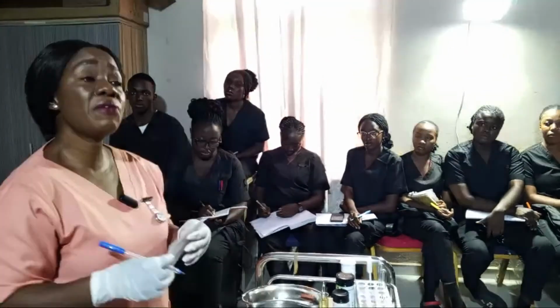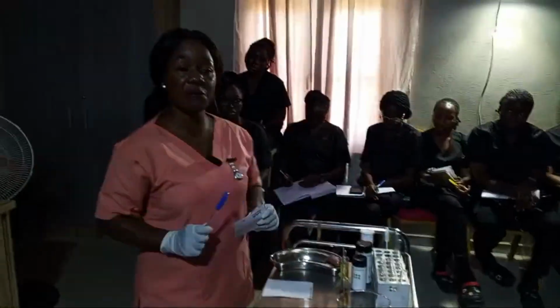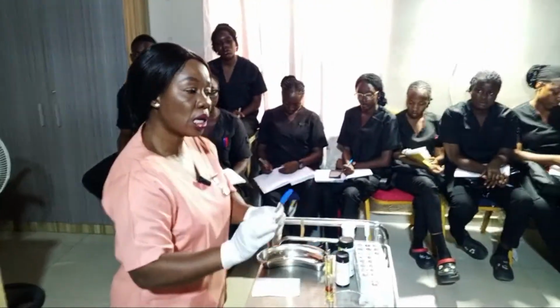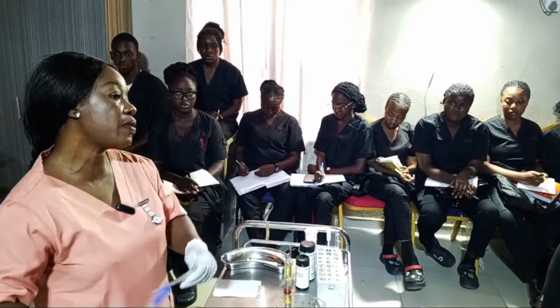You've recorded. If it is during exams, you give it to your examiner. Sir, this is done. Remember, if it is a procedure that you are being asked to carry out, as you are doing the procedure, you want to report as you go. Report as you go means what? I am checking the physical examination. The physical examination of this urine means I have to check the deposit, the color, the amount, the odour, right? You keep mentioning. So that is reporting as you go, or report as you carry along.